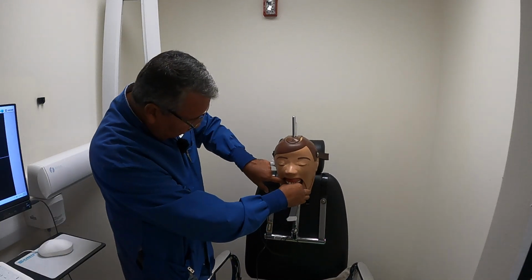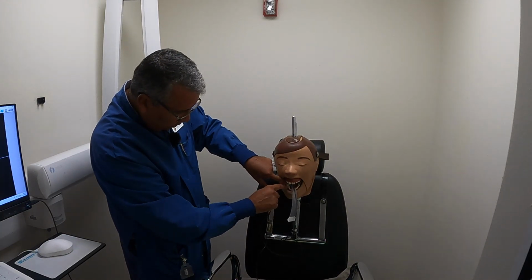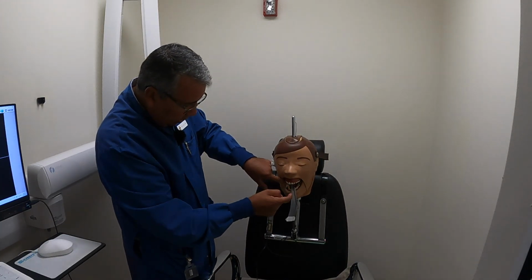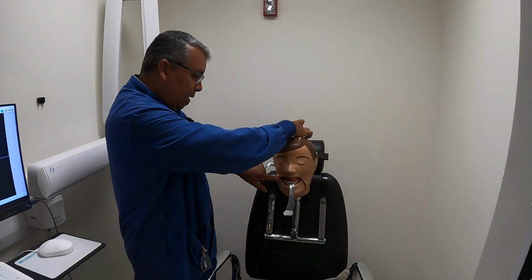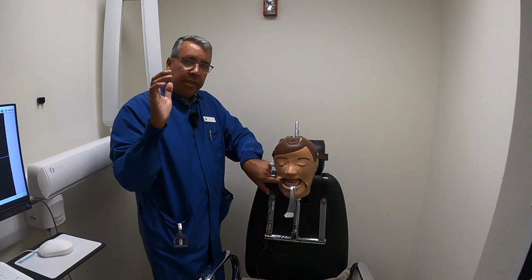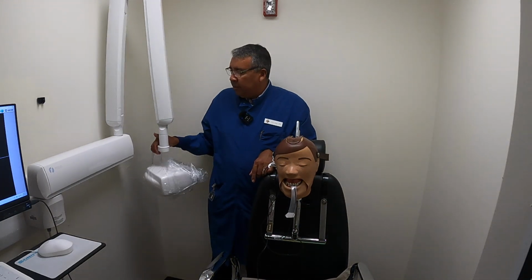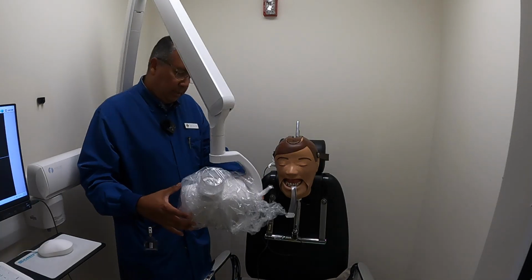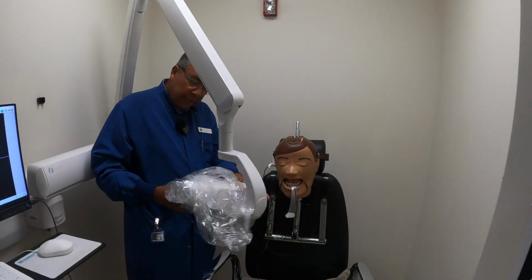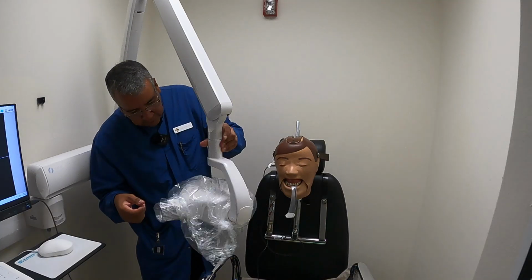Okay, so now I'm feeling for that sensor. Is it covering the second premolar? It is. Bite down slowly, close all the way. I won't take my finger off until the patient is completely biting down. And now I can go ahead and grab this. How do I find my vertical? For now, it's on 0 degrees. I'm going to go back to 0 and place it on there just for our purposes here.